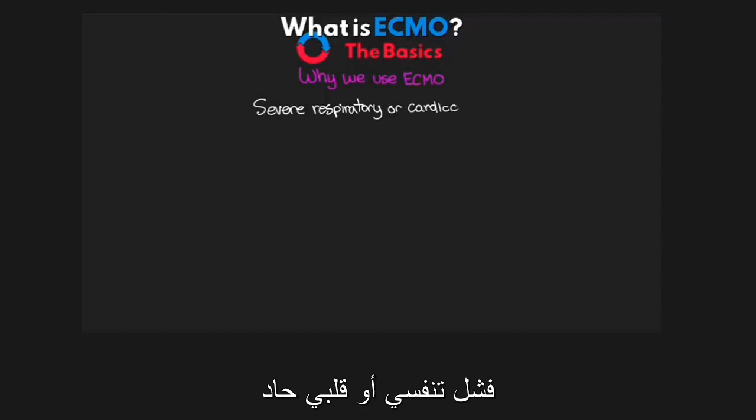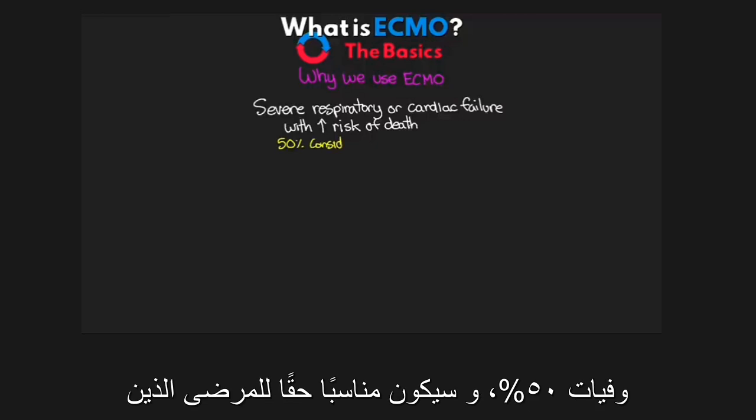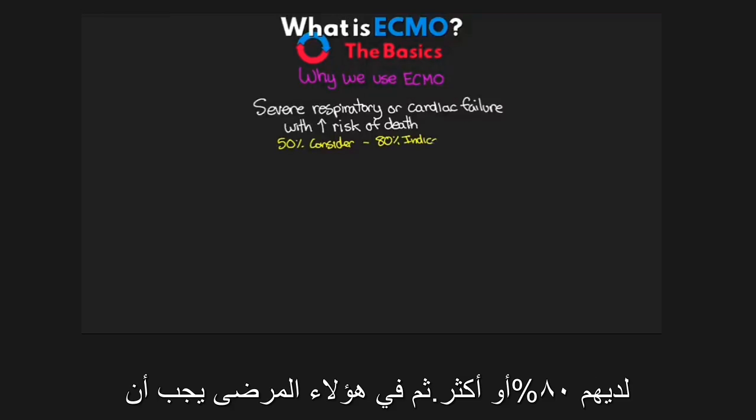So we're going to be using ECMO in patients that either have severe respiratory or cardiac failure that have a high risk of death. We want to consider ECMO in patients that have a 50% mortality, and it's really going to be indicated for those patients with 80% or more.